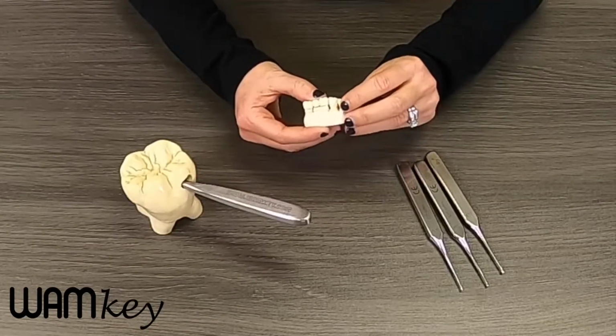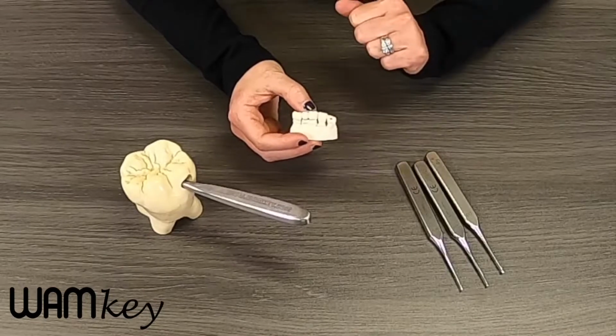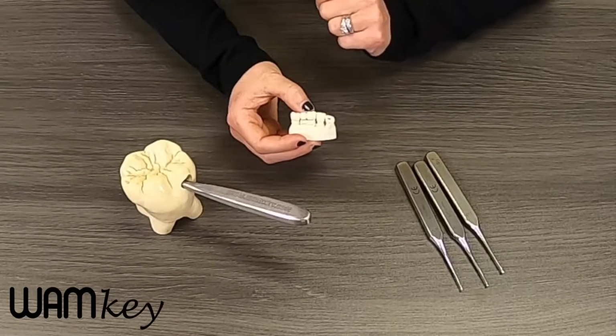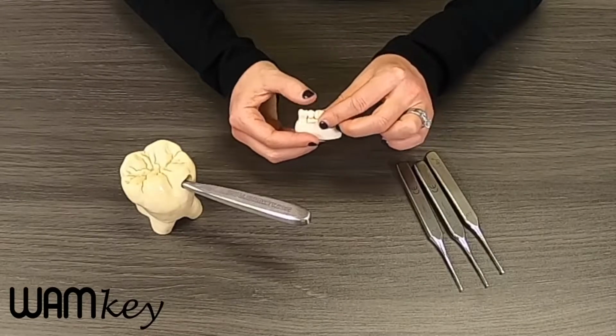So if you have a patient that comes in and let's say one abutment is loose, the other side is still cemented on, what you would do is you would go ahead and work on the tooth that's still cemented on to break that bridge free, and then you can assess to make sure there's no damage and re-cement.